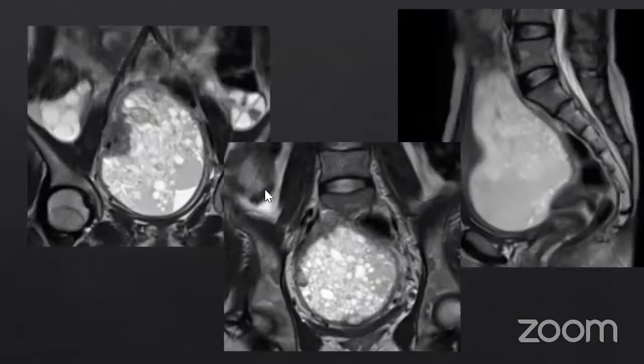Case number 8 on your screen. Easy diagnosis, kind of a spotter only. So what do you think this is? Dermoid, but all of these are T2 weighted sequences. I don't think we can see fat confidently here. See the appearance. And I know all of you who are tuned in know the answers. If you just see the kind of morphology, what is the descriptive term which you're going to use for it?